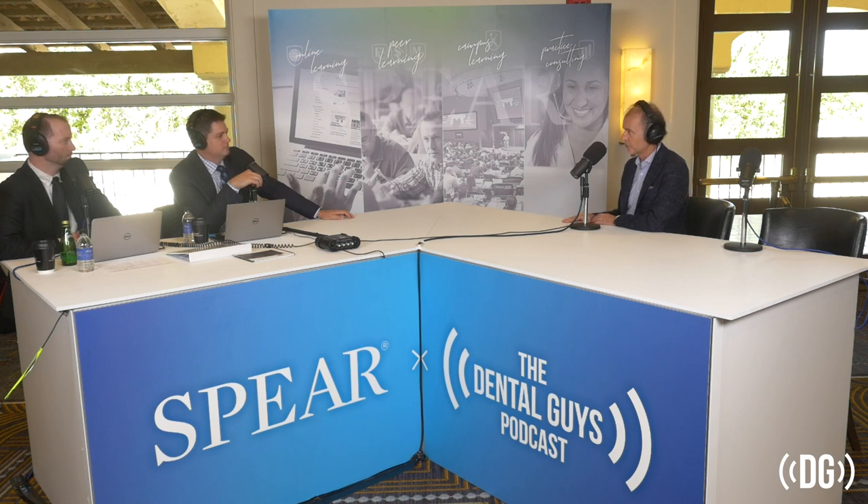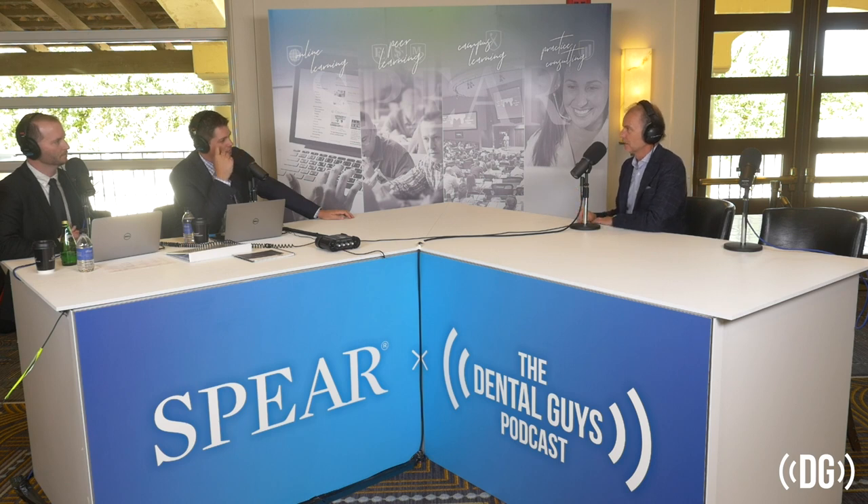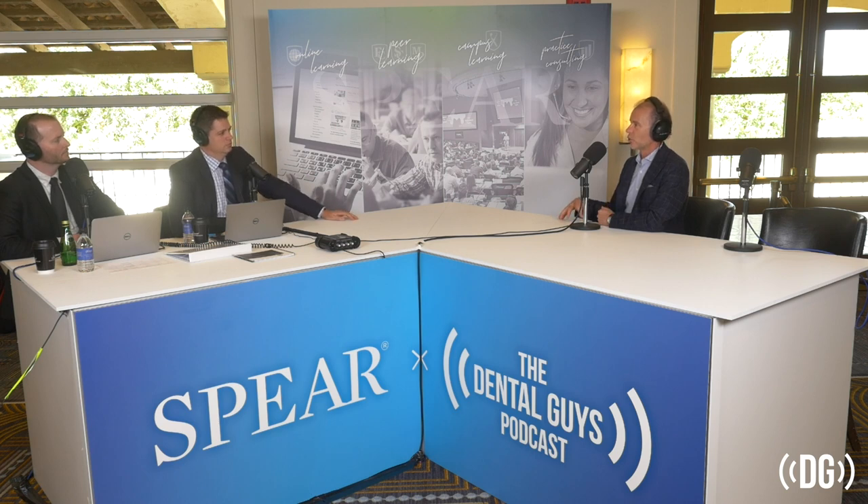Now I do the labial depth cuts first. I have people in training take a marker and draw a line about two and a half millimeters from the incisal edge, then put the diamond bur in that line. Then when I go to the incisal edge depth cut — let's say I'm going to do a two and a half millimeter reduction because I'm doing a layered restoration — that depth cut essentially finishes the incisal third of the prep. Once I've introduced that, running 35 to 40 people through the workshop every time, I see a dramatic improvement in outcomes. I've developed a lot of concepts over the years to do things more precisely and accurately, and consistency is the key — this helps a lot of people prevent over-prepping.